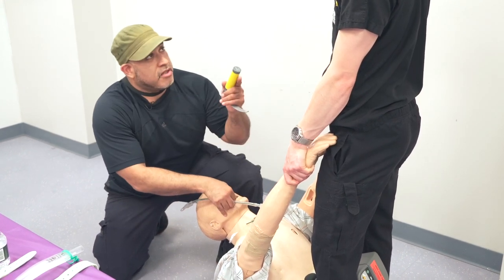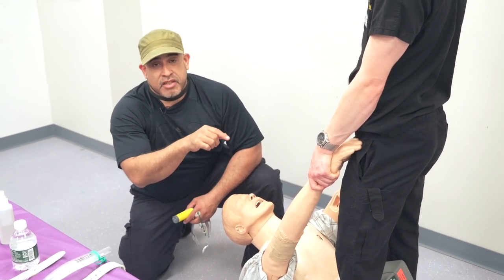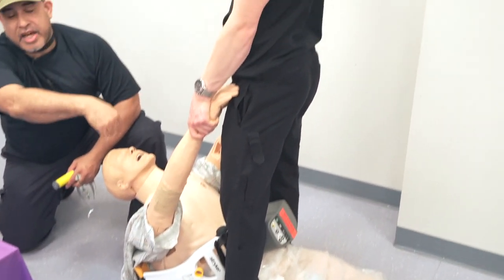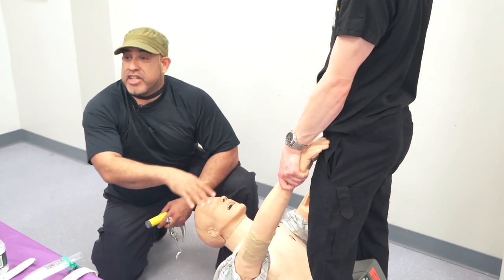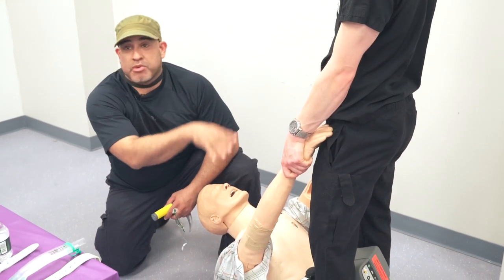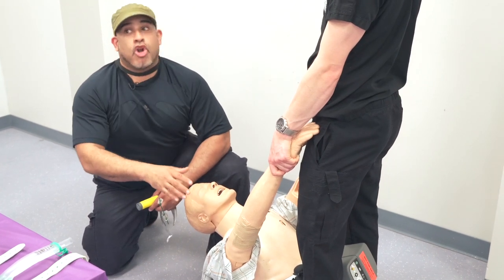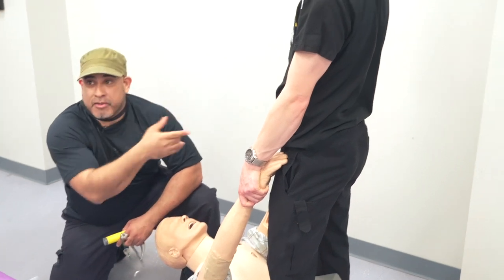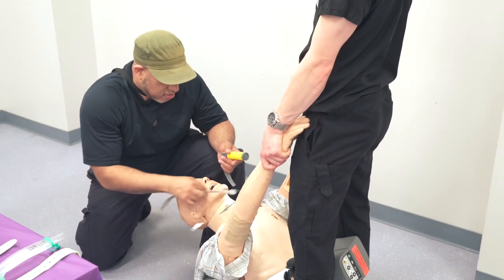So you're doing okay? What's ideal with this technique is he's bracing his weight down and using leverage. This is not a heavy patient, and that's why he's able to do this long enough. If this were a heavy patient and he was deadlifting, his arms would tire out already. So with this technique, a petite woman, petite man, large woman, large man, anybody could do this. But your helper has to know what she's doing. You're doing good? Yeah. Okay.